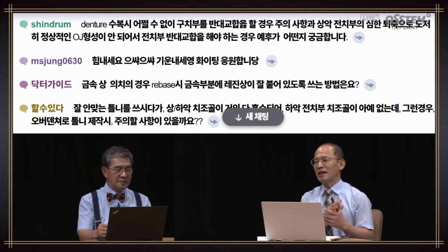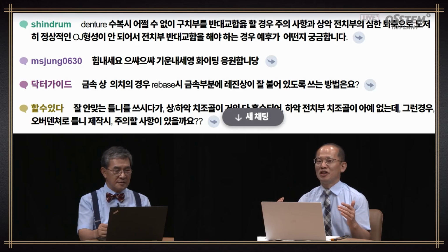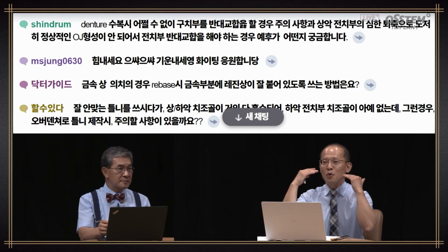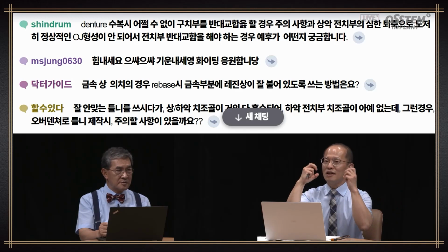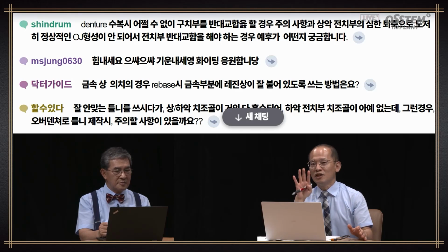The arrangement or alignment is not important. You just meet a set of conditions. You just stabilize when it's closed. That is the key. So you have to make it usable. If the denture becomes synchronous, then when the patient chews and there's force, coming into contact at the same time is key.